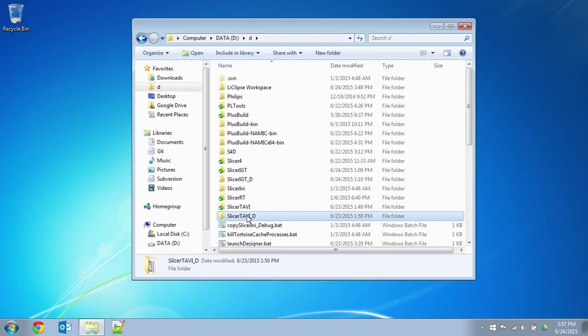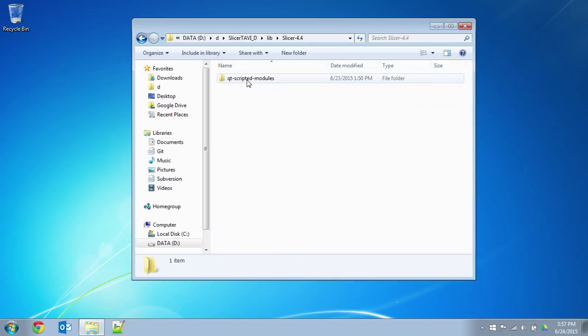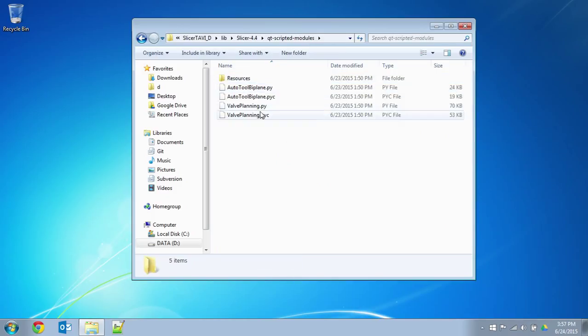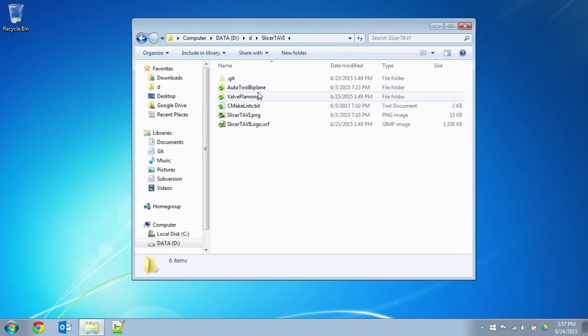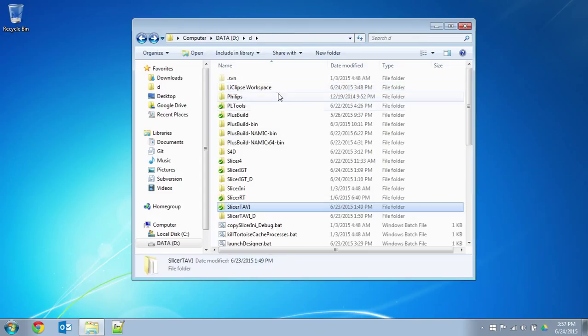And I want you to notice these because if you go into your build folder, there are two Python files here, AutoToolBiplane and ValvePlanning, that I'm going to use as my example. And then in the checkout folder, there are also these Python files. And this can lead to complications later when you're trying to debug. If you're putting breakpoints and nothing's happening, it's because you've used the wrong file. So I'm going to be working with my build files because this is the one that I'm going to point my Slicer to load the modules from.